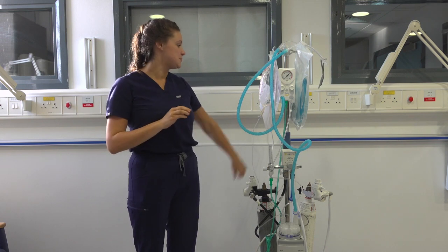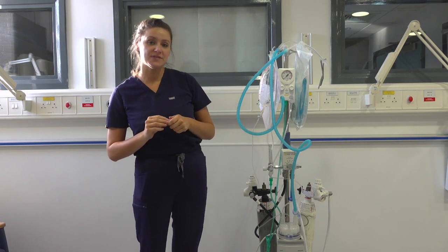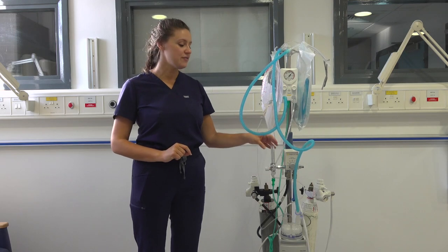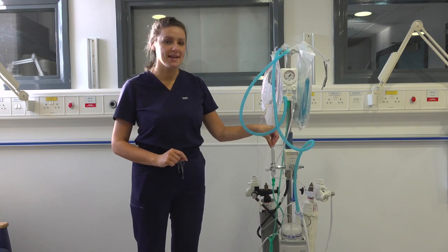Now you need to plug the machine into the wall and leave the water to heat for 15 minutes before delivering the gases to your preterm baby. Just as a reminder, the flow on your blender needs to be set at 10 litres rather than 8 litres.